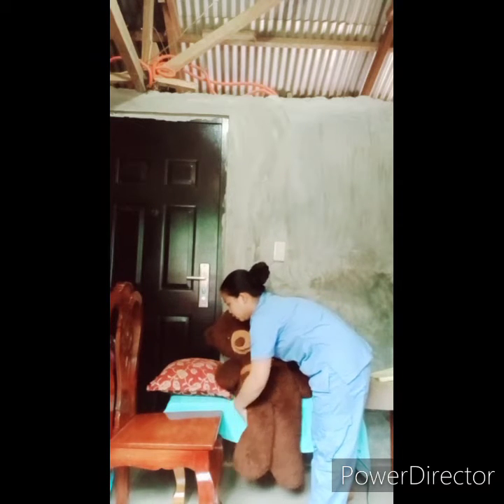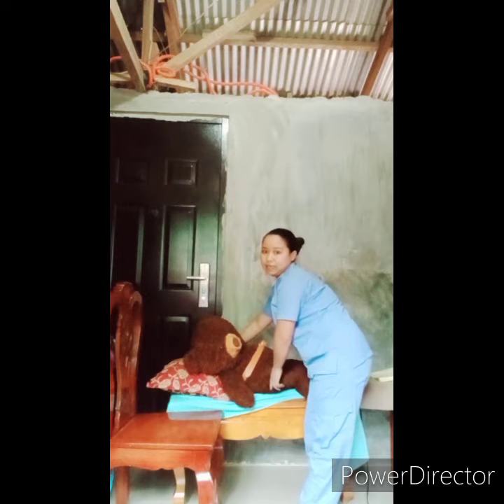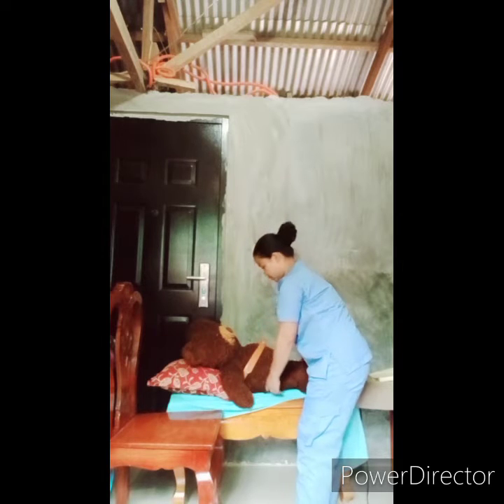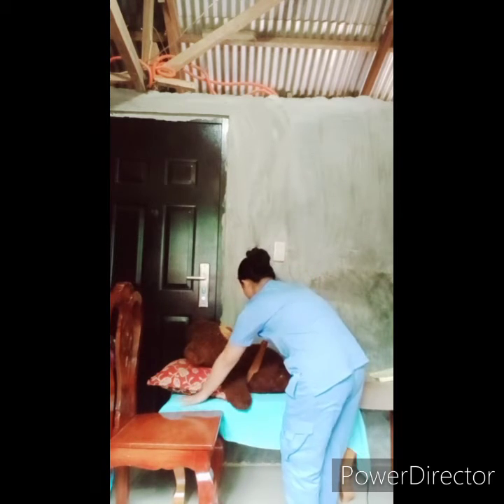Can you please lift your legs, ma'am? Okay. Then next, let's lower the shoulder onto the bed and keep our back straight. Then let's help the patient to position properly or to a comfortable position.